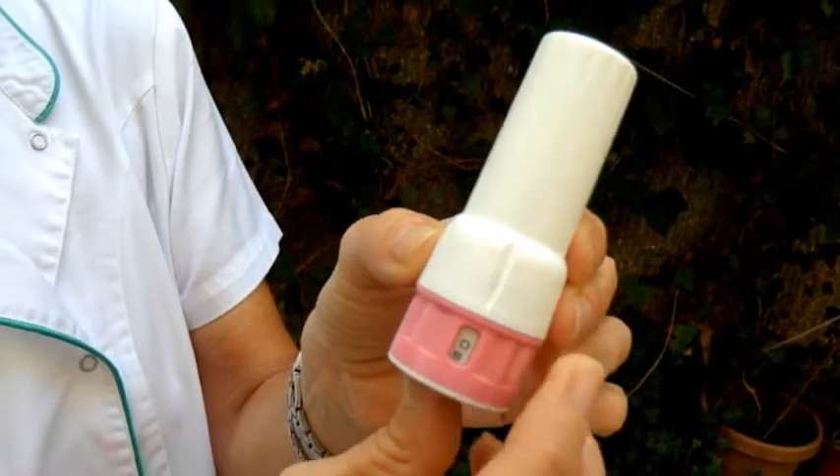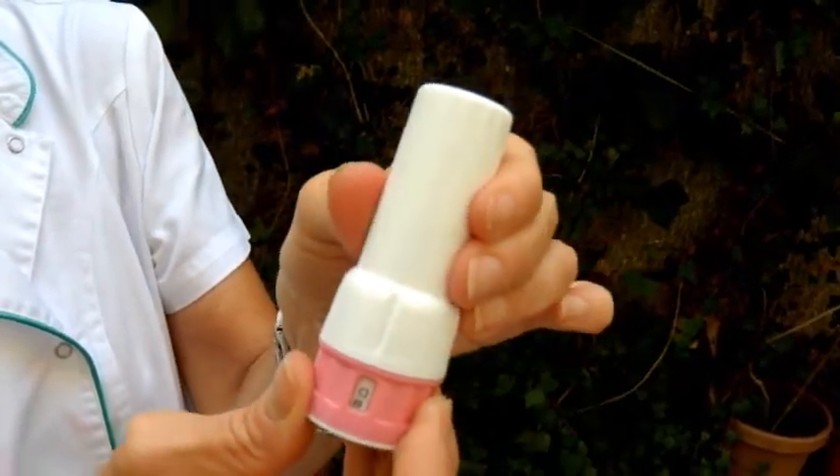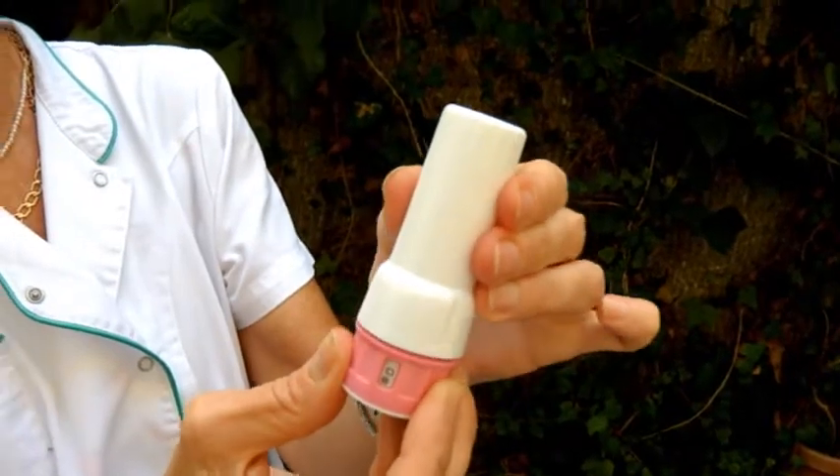The counter and the arrow should be aligned. In vertical position, open the cap of the Twisthaler.